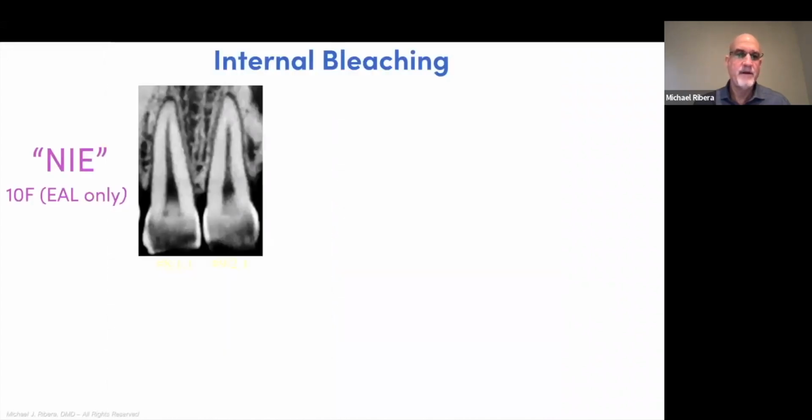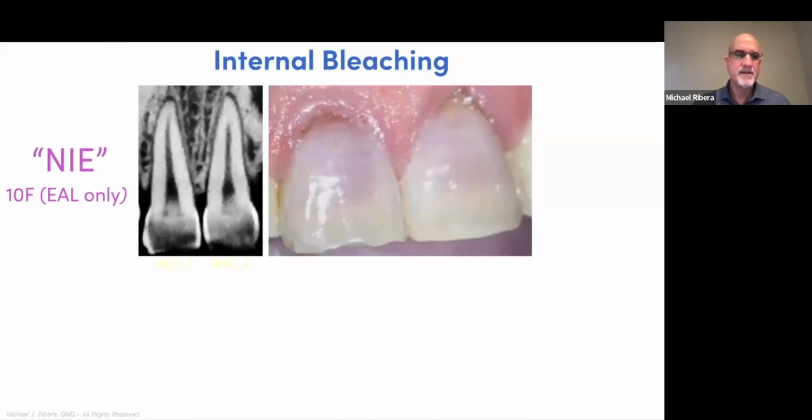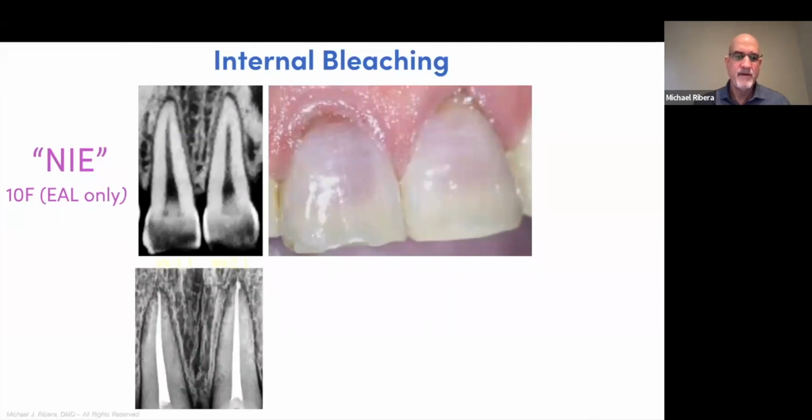Patient's doing well. This gentleman was hit with a golf club. His teeth became instantly discolored, referred. We ran GentleWave, nothing sexy here. We don't always get all these fireworks. Sometimes we just don't. Nothing sexy again, just 2 canals that were basically not shaped. We acquired a working length. The shape is there. The glide path is there.